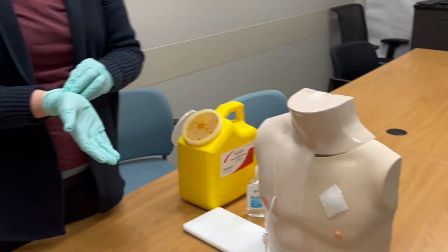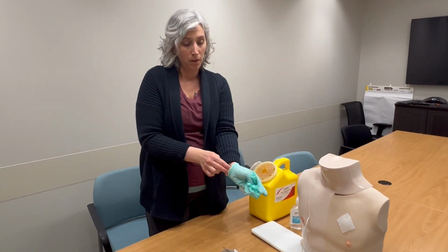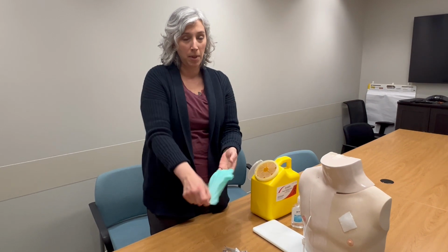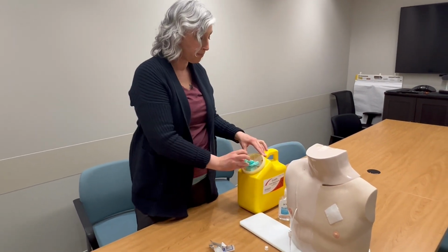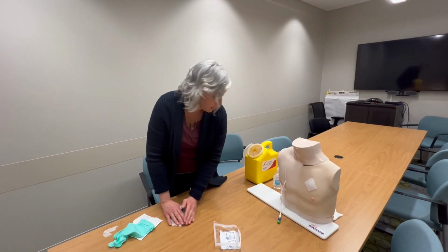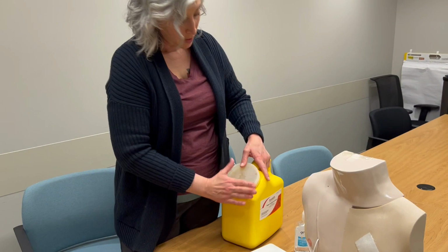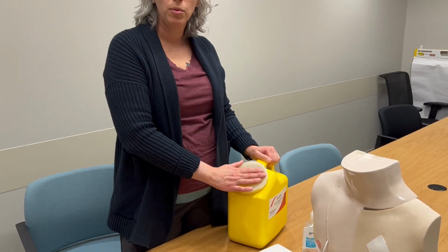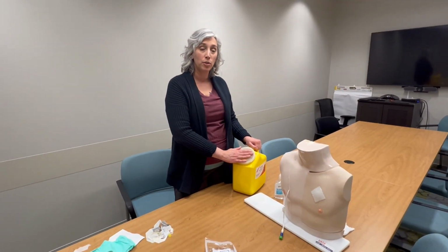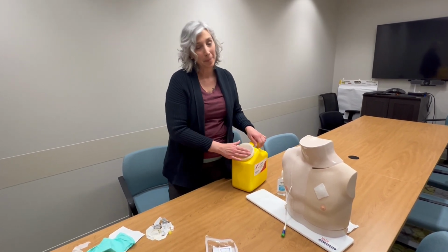Okay. You're going to remove your gloves and make sure these go in the chemo bucket. All these other wrappers can go in the trash. You're going to put the cover on your chemo bucket and put this away up in a closet or in a garage away from kids and pets until you need it for the next treatment.